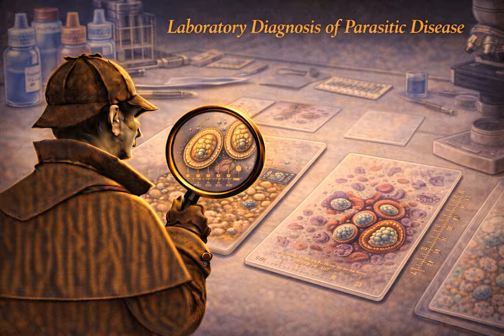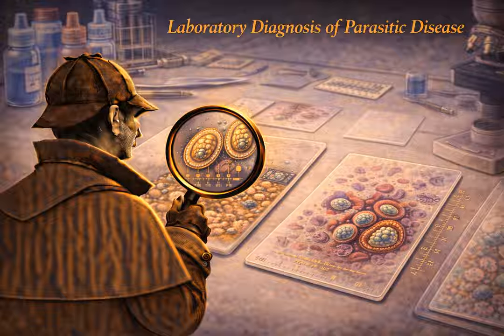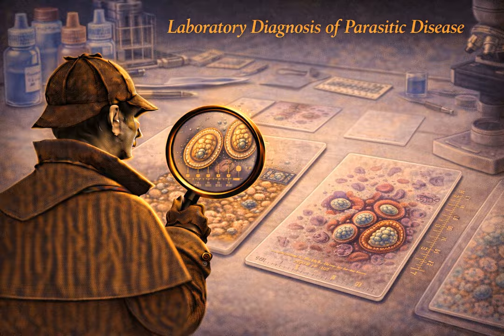And here comes our old friend, the biological clock again. Peak excretion of these eggs is tightly tied to host activity and is often highest right around midday, between 10 a.m. and 2 p.m. So you want a noon collection, last drops only.